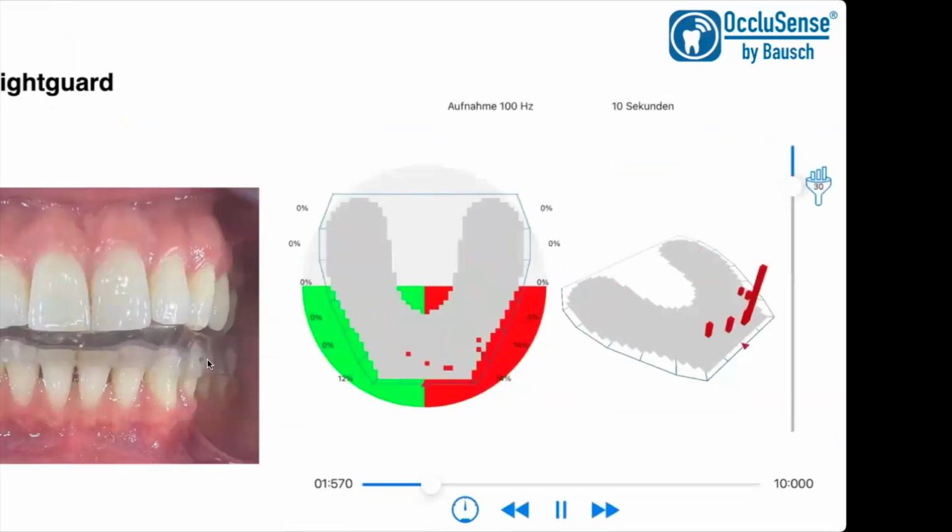And again here just to show the splint, we usually raise in the articulator, well the lab raises in the articulator about 4 millimeters, and then they start fabricating the splint until they get an evened out occlusion. And obviously this also differs when you are trying to fabricate a front plateau and trying to get the dynamic occlusion over canine movement.